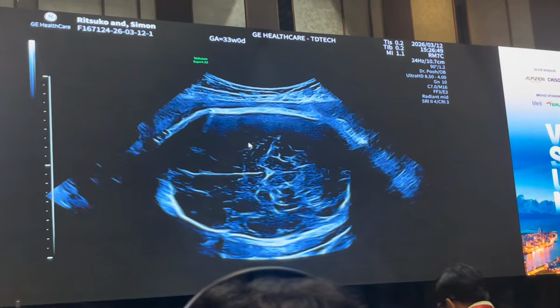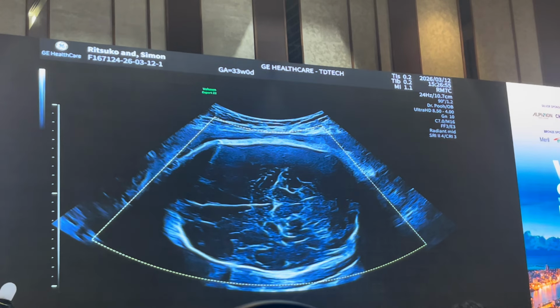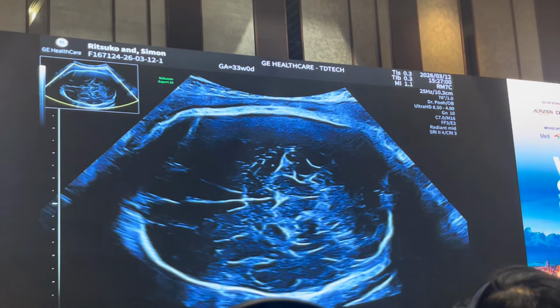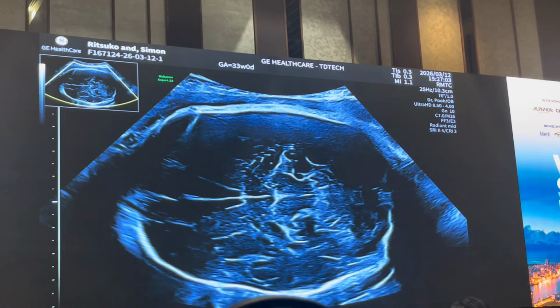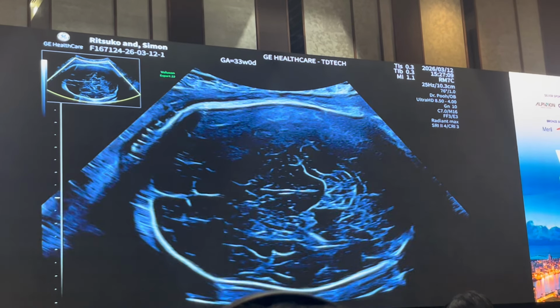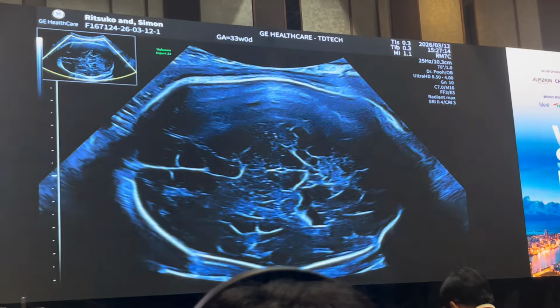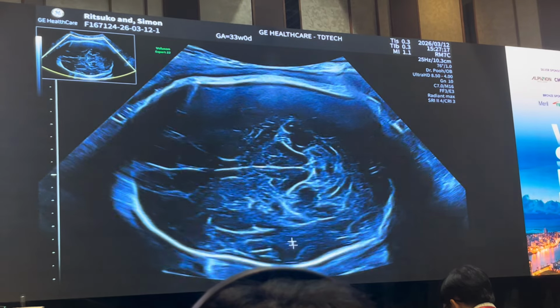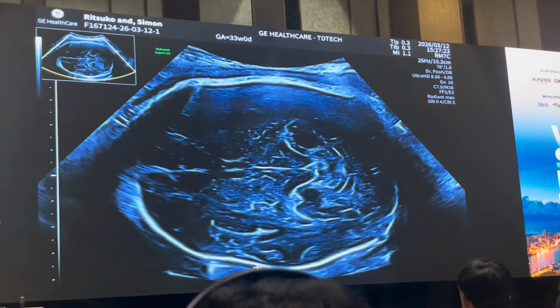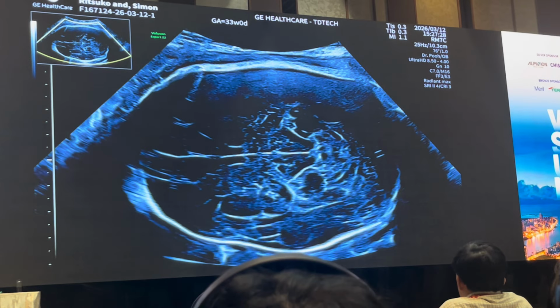Once I've done my depth, I then do very slight magnification, not by total zoom, but by HD zoom. Oh, beautiful. And then my settings are radiant mid and radiant max. And that gives me nice definition. Okay, take another seat. So if we look down lower here, we can see the definition of the fetal skull.